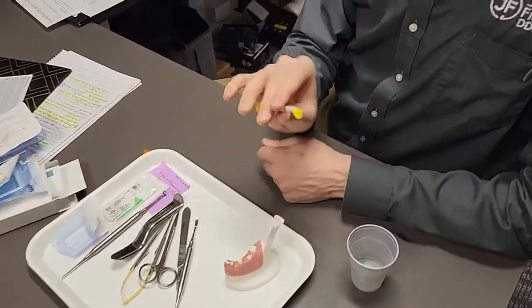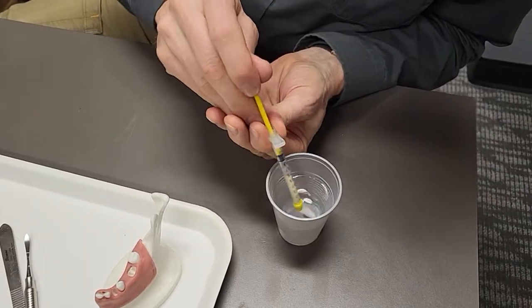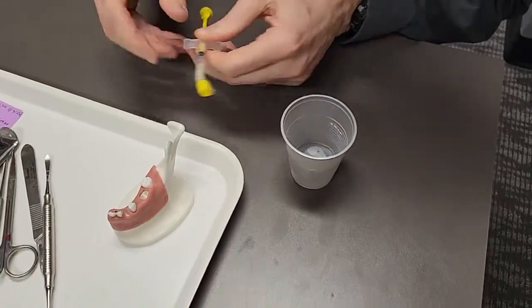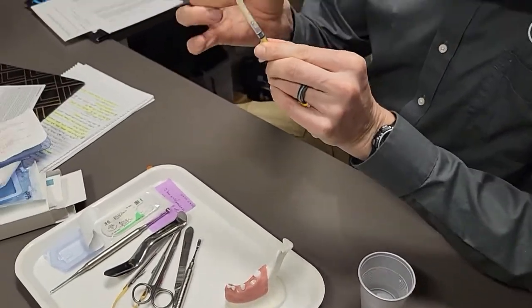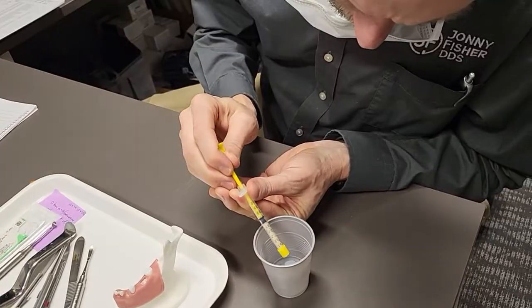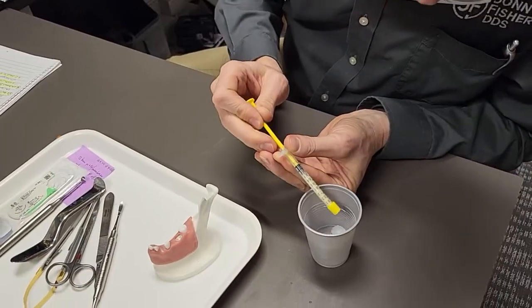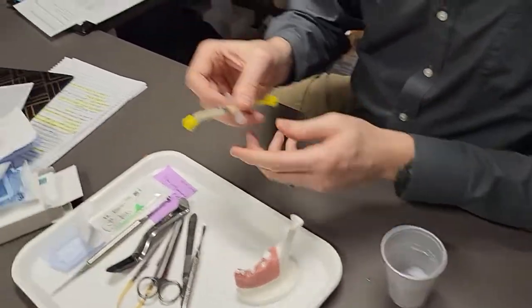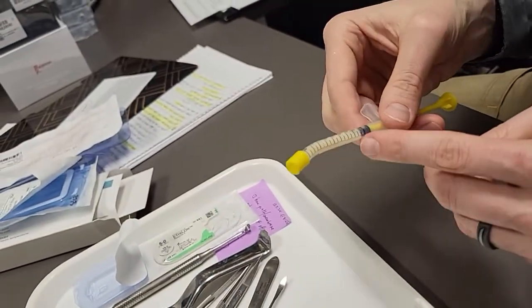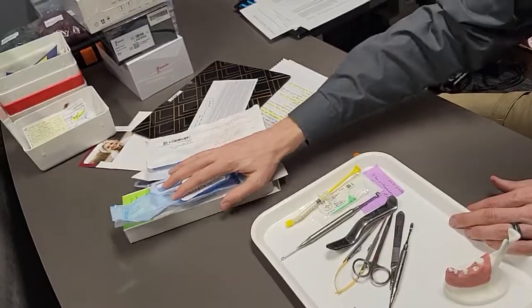You take off this tip — it's got a little grate across the top. You pull in some of the minocycline water and sometimes it takes a little bit of squeegee action to get that set in there, and then a little tap, tap, tap — so you look like you're on Grey's Anatomy. The bone is now sitting in there; I pull up kind of to the top and there's liquid all in there and the bone kind of pulled back off. That's now hydrating with the minocycline water as well. Set that aside, let that marinate.